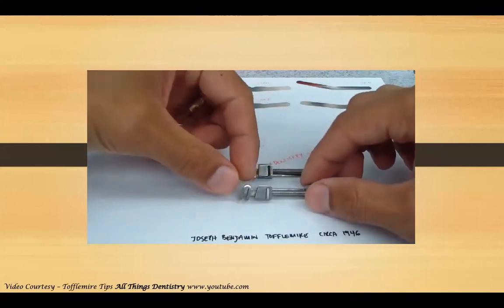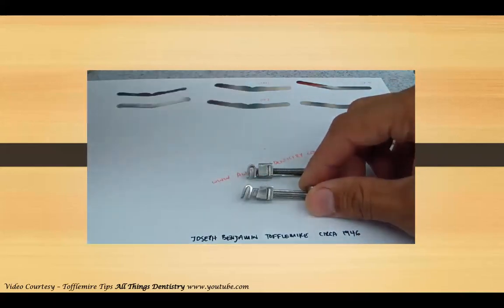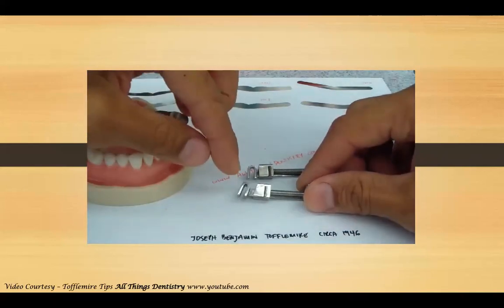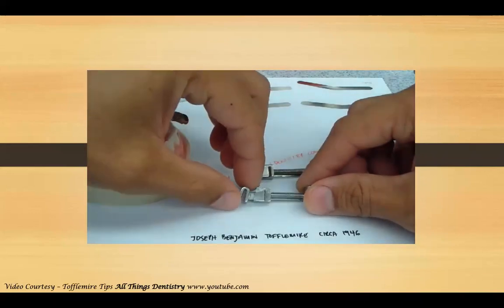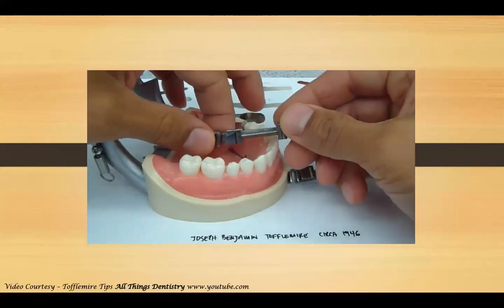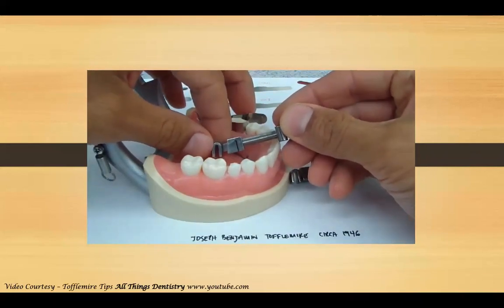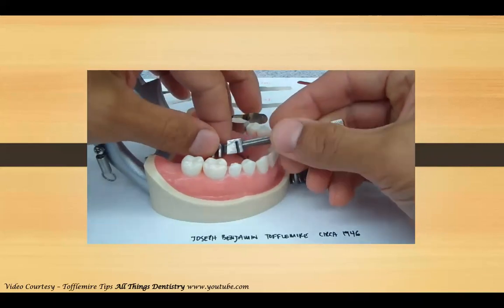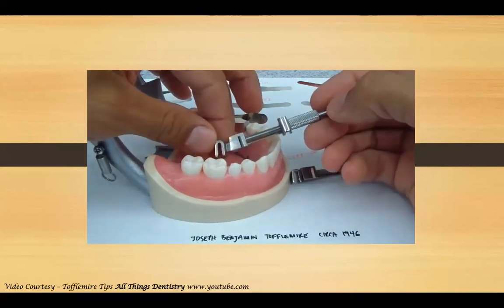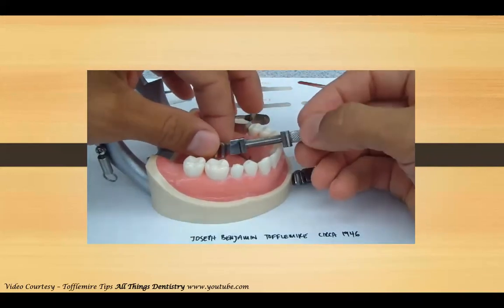Now, the reason why this is like this is because it can be used lingually. I remember learning that in dental school thinking I don't understand why, I just know that this is for the lingual version. No one told me why. Well, here's why, as I just figured out from cutting the video. When you place it on the lingual portion, even of the palate or the mandible, it has to be angled in an effort to jump the teeth, if you may.